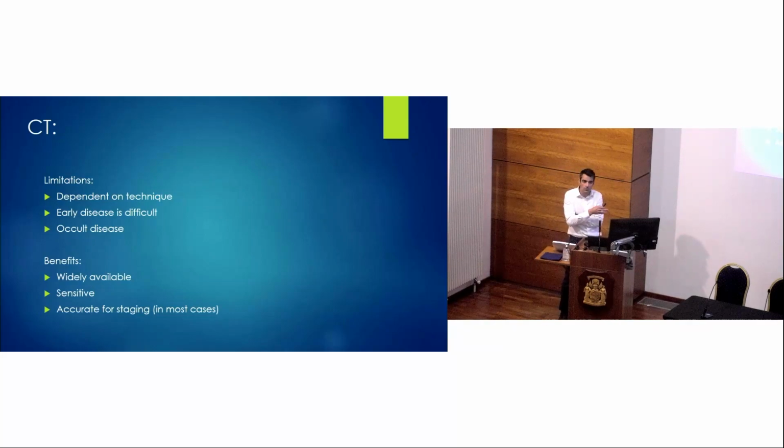And often the technique we will use is to look for the absence of upstaging disease. So we look for the absence of mediastinal invasion or the absence of pericardial invasion. And by that we can infer that the tumour stage is earlier. Occult disease can also happen, and we use PET-CT sometimes preoperatively, for example, to make sure there's no surprises. And we will sometimes pick up things in PET-CT that we haven't appreciated in the standard CT. So that's a quick run through, as I said.